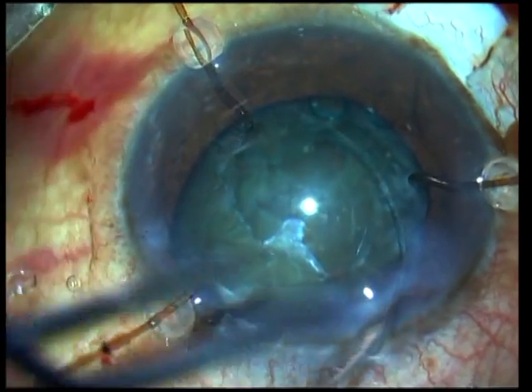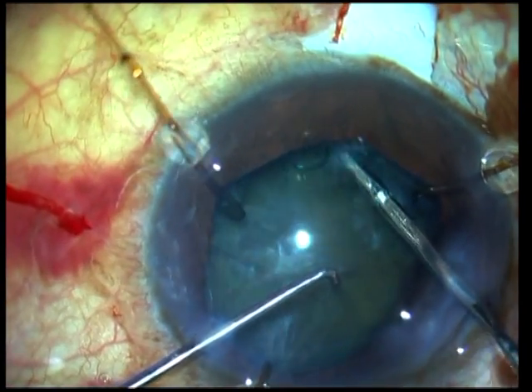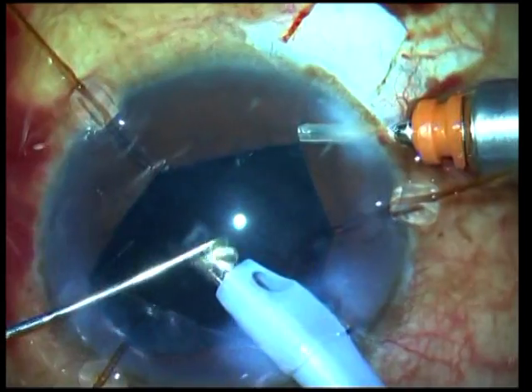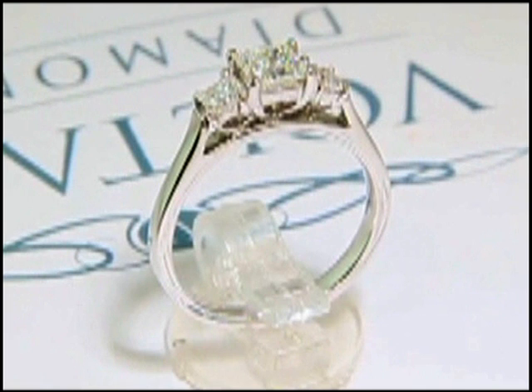It gives you horizontal support. A CTR can then be safely implanted for fornicial support, and the glued capsular hook continues to give intraoperative as well as postoperative support and centration to the capsular bag. So knowing how to implant a CTR can turn the ring of horror into a beautiful ring, as long as you follow the pearls.